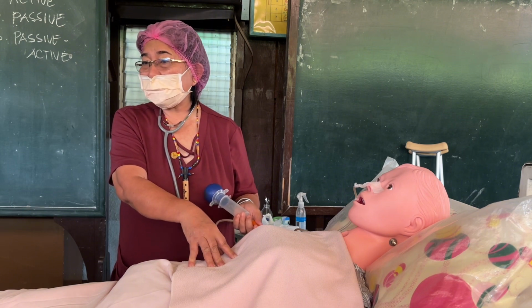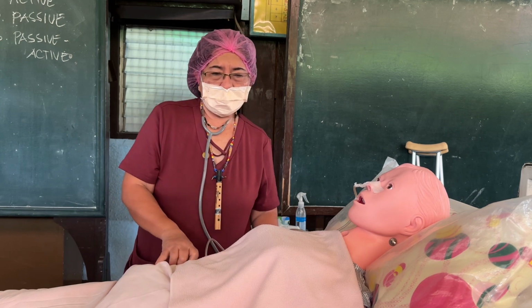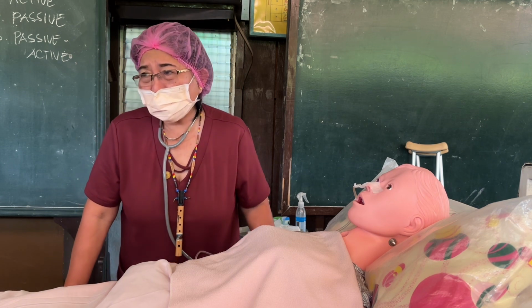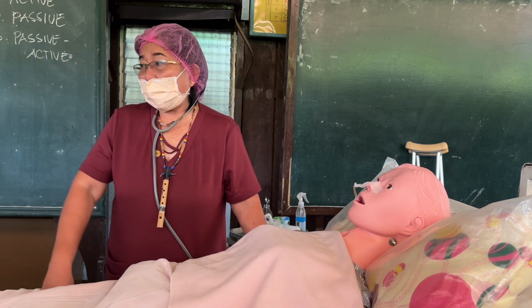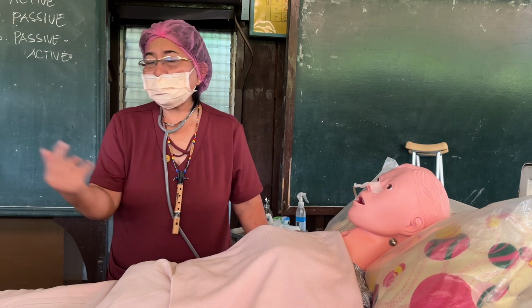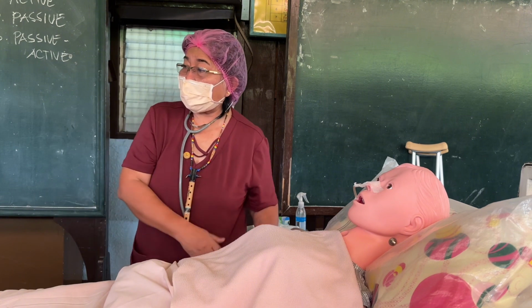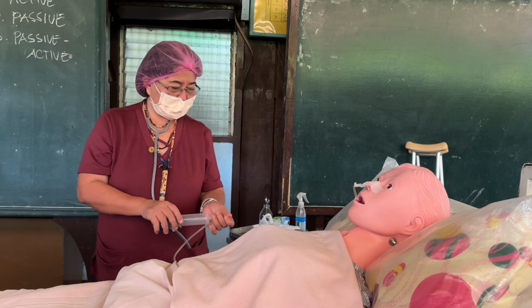If the patient is on NGT feeding, do we apply flushing and irrigation? Yes or no? No! This is a different case. This is post-op abdominal surgery, for decompression. In feeding, the purpose is for the patient to get calories. Now, we wash out the stomach, and drain it. So this is a different case from before. Okay, that's number 5, procedure.